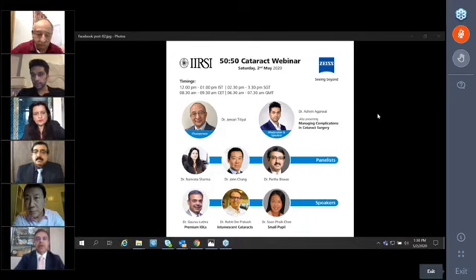So what Namrata said is absolutely right. That would be the last resort. And typically, in eyes with a very, very tight, small pupil, which is really rigid, I would not go with one of the rings, because it's sometimes difficult and the stretch will be phenomenal.